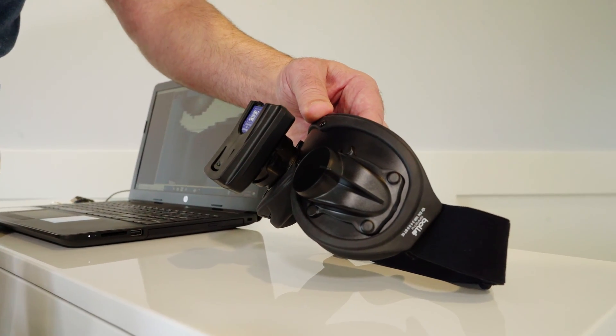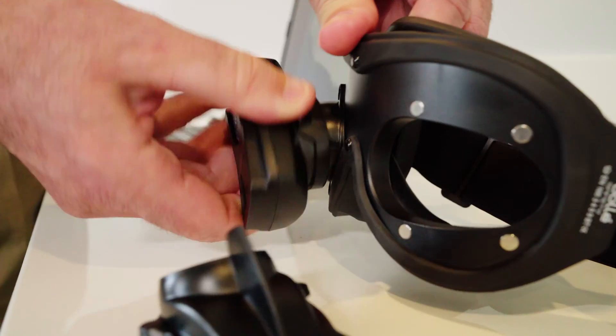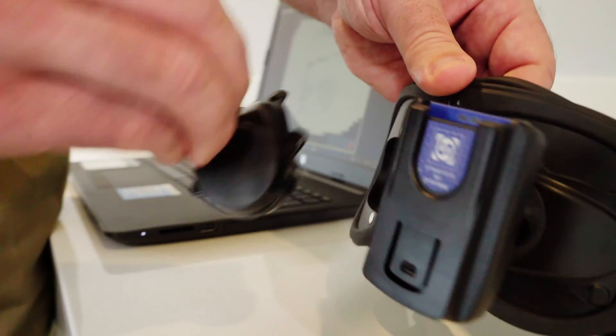If there's a dysfunction on the right eye and we need to make a change and test the left eye, we can remove the occluder, turn the camera upside down, switch the camera to the opposite side, and replace the occluder.